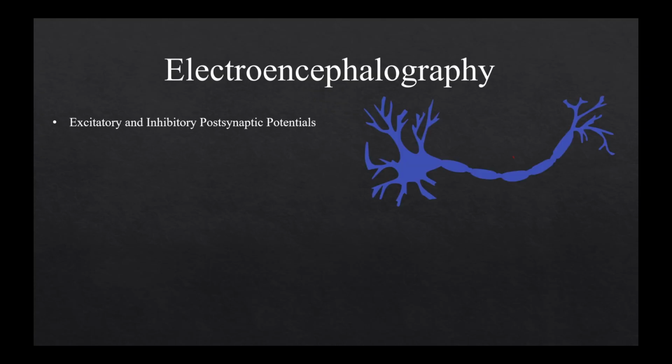Remember that. It provides the continuous electrical activity of our brain at the macroscopic level. So always remember, it provides the electrical activity at the macroscopic level. EEG basically measures the summation of the excitatory and inhibitory postsynaptic potentials. Either it can be excitatory or inhibitory postsynaptic.